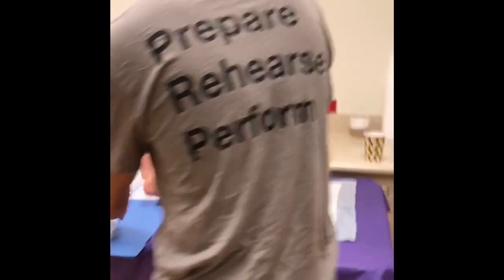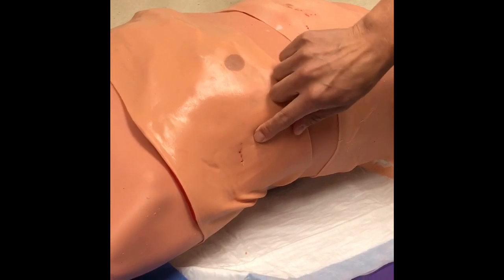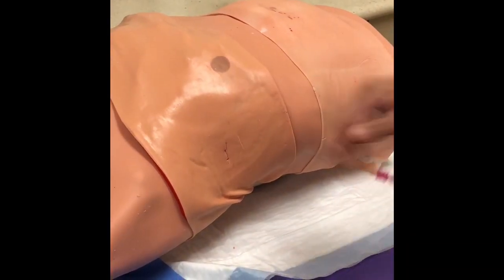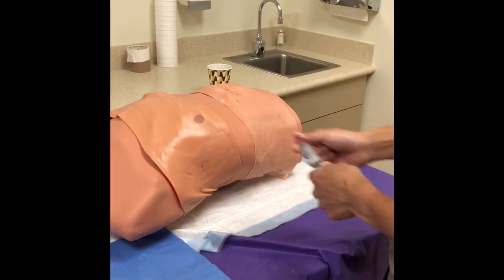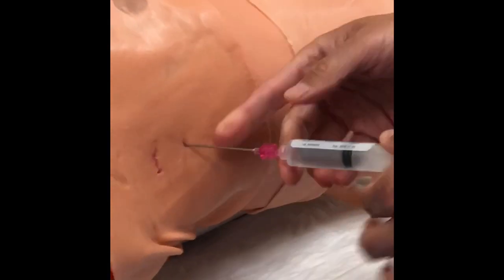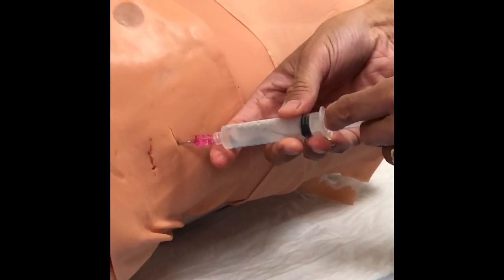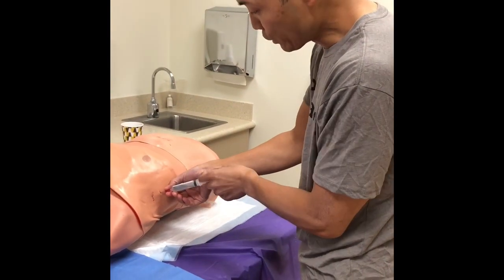Find your site of insertion, find the rib, and make an incision about two centimeters long right over the rib. Here's where most people mess up: they forget to put a syringe with saline on the introducer needle. You need that to check for air bubbles so you know you're in. Go in on the rib, gently walk it up, enter the pleural space, and you should see air bubbles. If you get resistance and no air bubbles, you're not in the space.